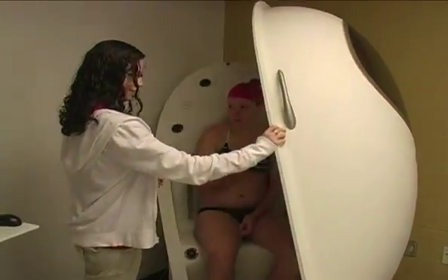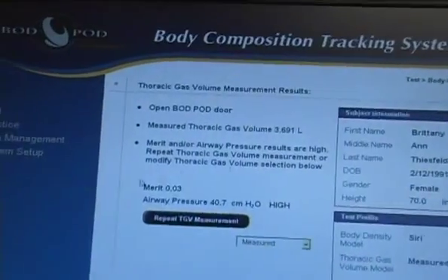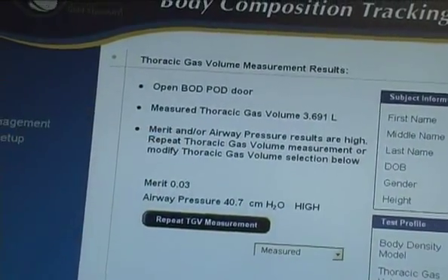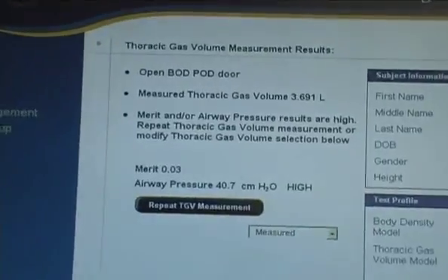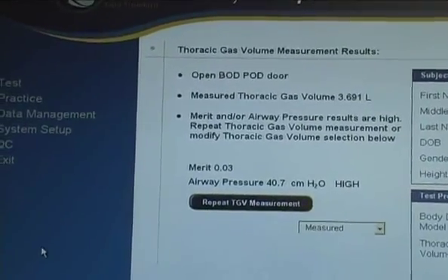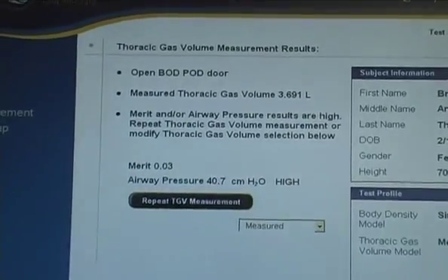All right. So we click next, and this is where we determine if she complied with the maneuver properly. It will tell you whether or not you have performed the maneuver correctly. And it says merit and airway pressure results are high. Merit is the compliance with the maneuver, how well she did. If it's high, you may have broken the seal a little bit. So just try to maintain a tight seal. And the airway is how hard she huffed. You huffed too hard.